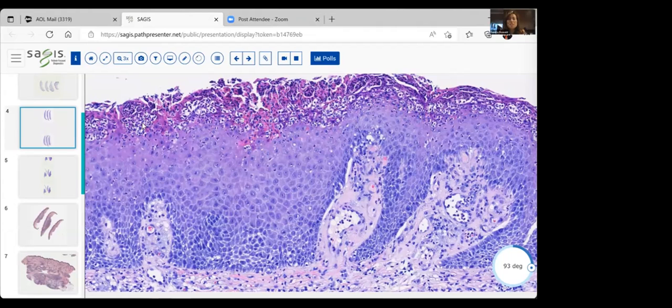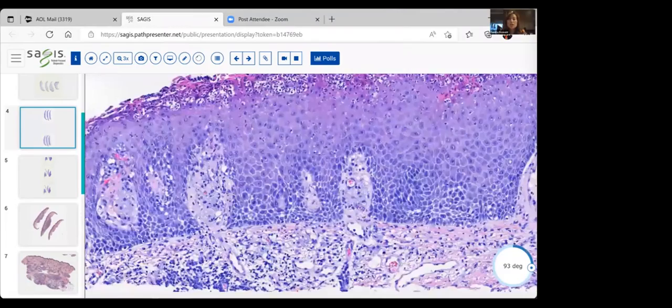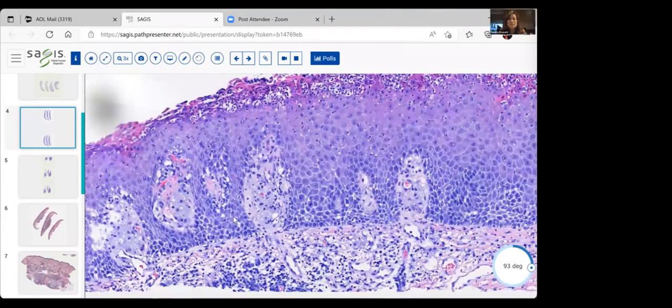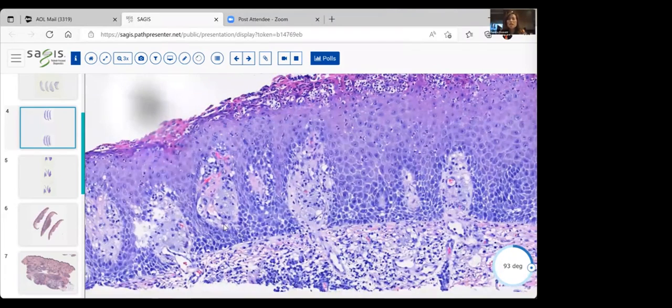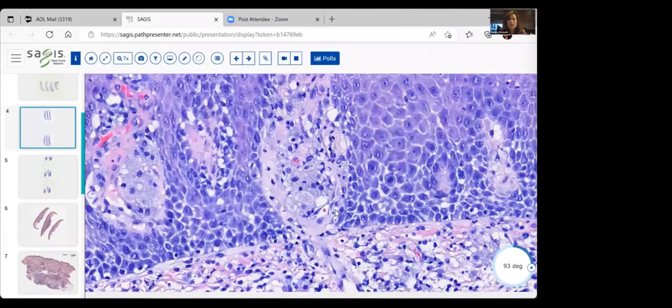Well, then, when you see something that looks viral-like, as in this case, you may want to look very carefully at the upper dermis. So let's look at the upper dermis and see if we see anything unusual. And I think already you see that there is a bluish kind of coloration, foamy cells up in the papillary dermis, not deep in the tissues, just right here up against the epidermis in the papillary dermis. If you look carefully, what do you see? All right, let's go ahead closer.